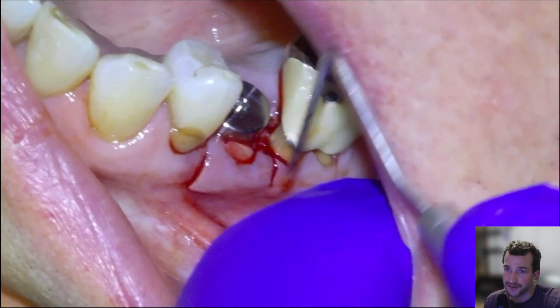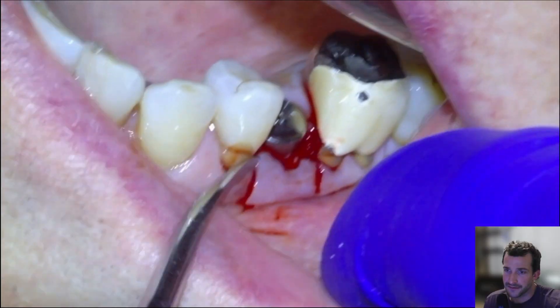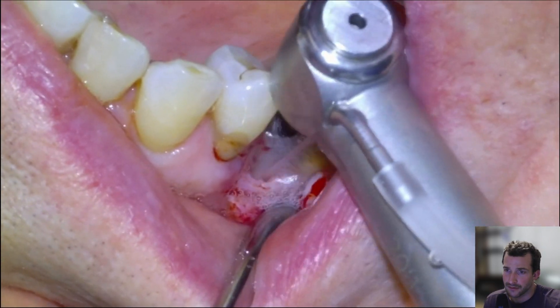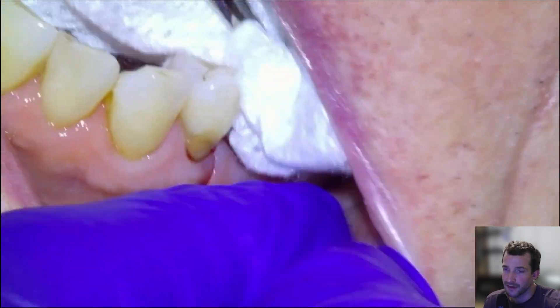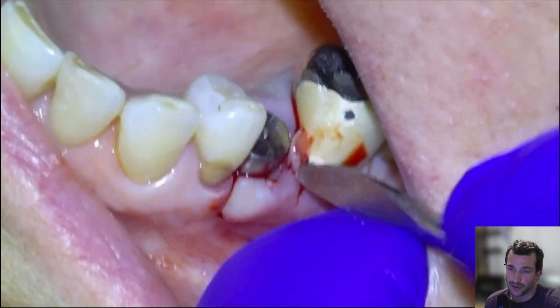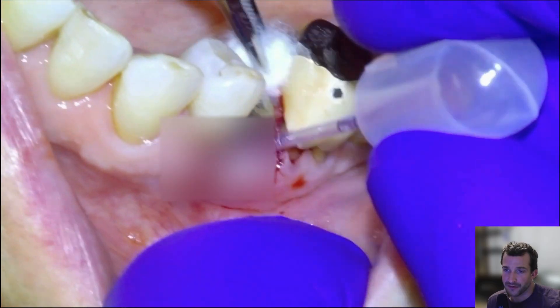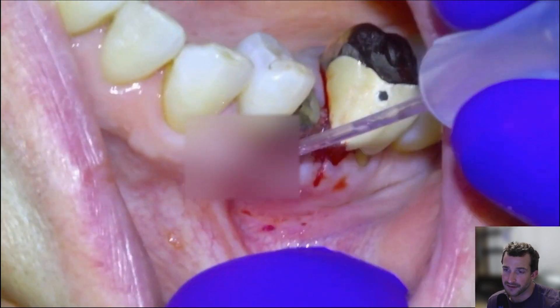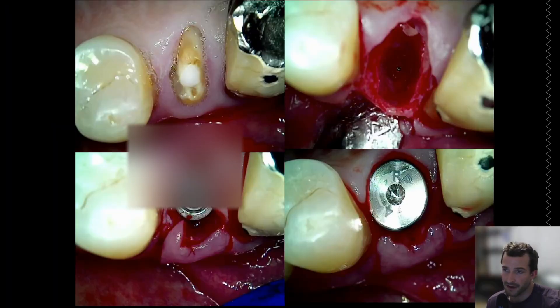We'll leave it like that — you can use a suture if you want, but we decided to use a tissue adhesive. We're going to flush that area out with saline so it fills in with fresh blood before we close it up. Tissue adhesive is going to work well — it's meant to be bacteriostatic or bactericidal, so there are no concerns about contamination; it'll just disintegrate, absorb, and heal up. The patient's going to be back in three months. We'll take a scan with a scan flag, intraoral scan flag, and then make their crown with a stock abutment.